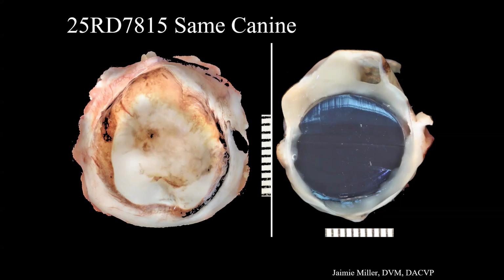So we've got the globe. That glass does not work. Put that one way over there.